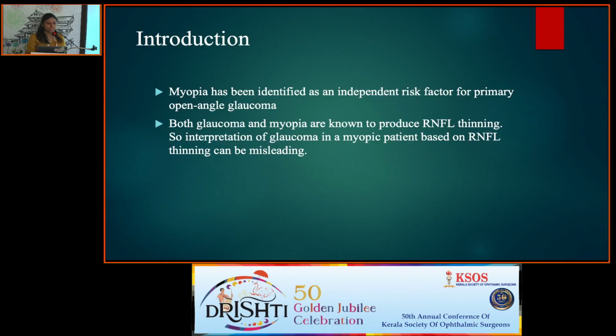Myopia is identified as an independent risk factor for POAG. Both glaucoma and myopia are known to produce RNFL thinning. So, interpretation of glaucoma in a myopic patient based on RNFL thinning can be misleading.